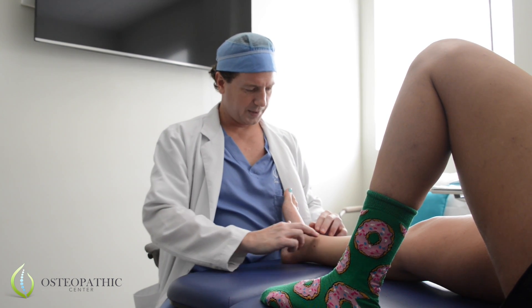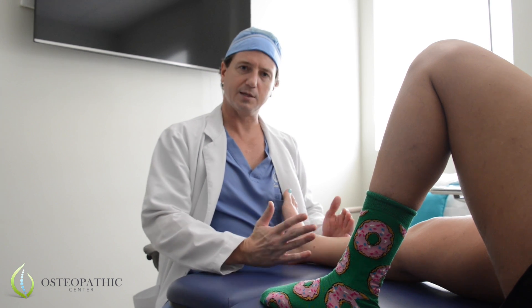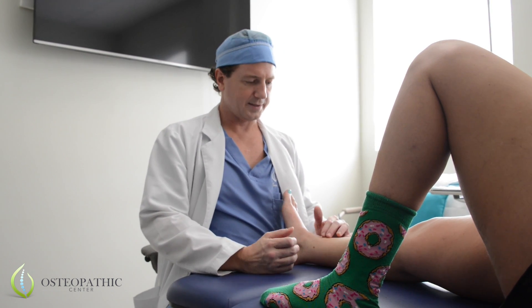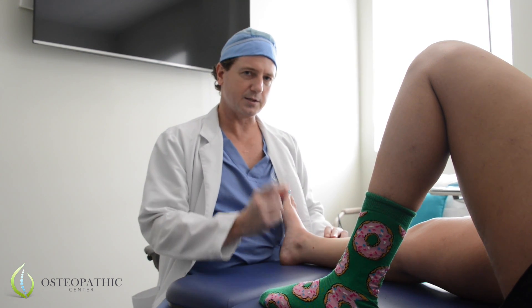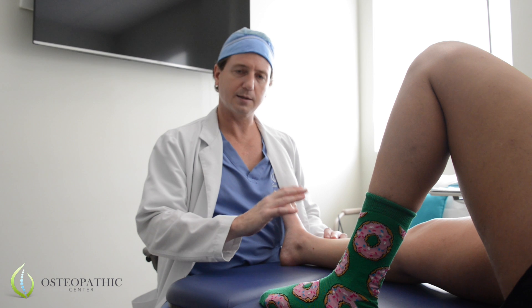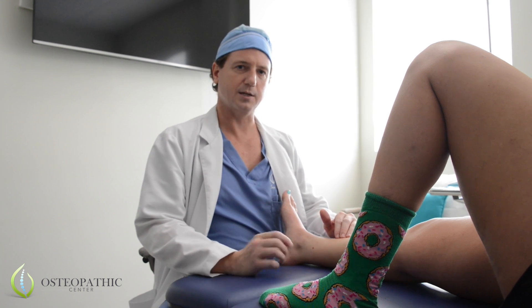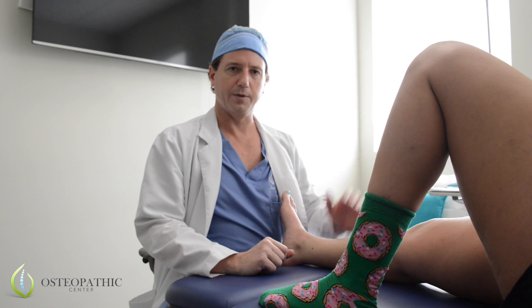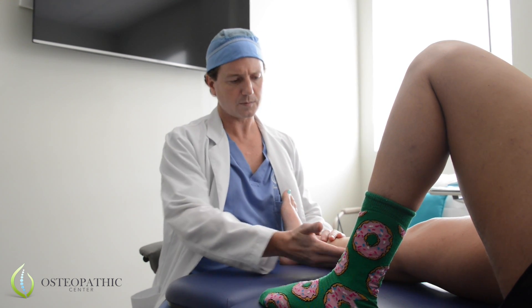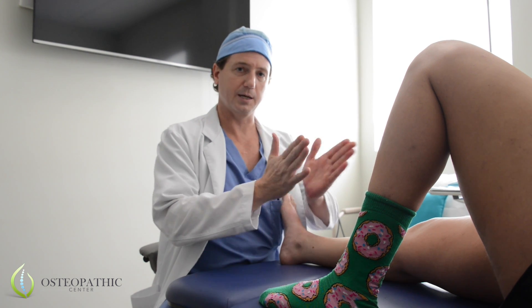In this case, there's pain right along the bone, right at the attachment where the syndesmosis comes in. It's not always apparent on imaging. I did look at it with ultrasound and there are just small things that, if there were no pain, we probably may not have identified as injury. But since we have pain and tenderness significant enough that she can't do any activity, I would call that abnormal on the ultrasound.